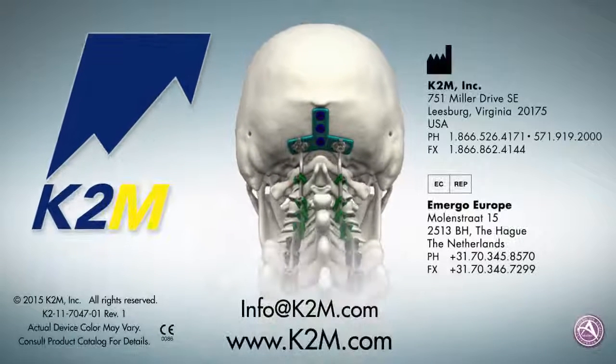The Caspian Occipital Plate System from K2M, Complex Spine Innovations.